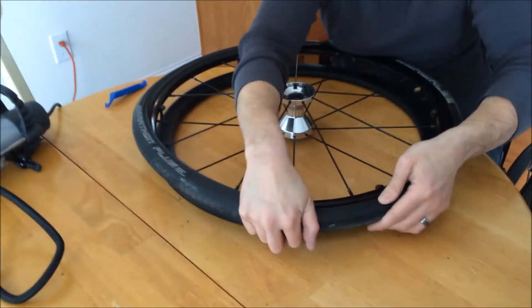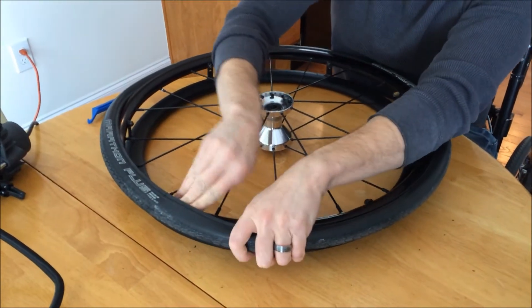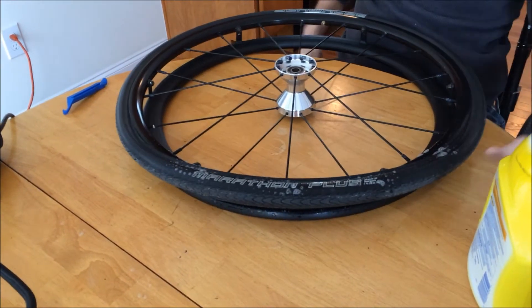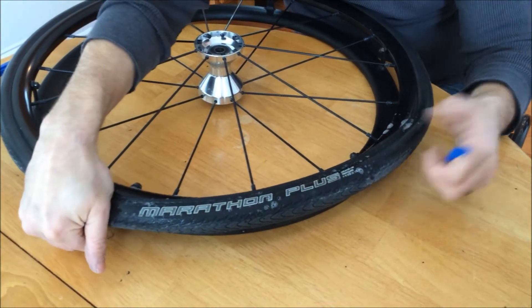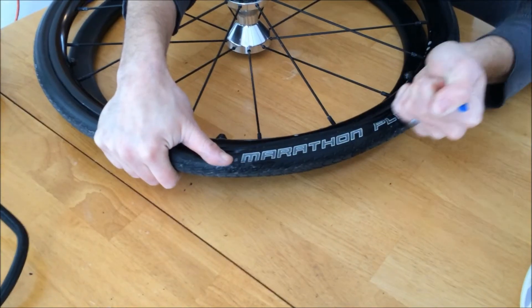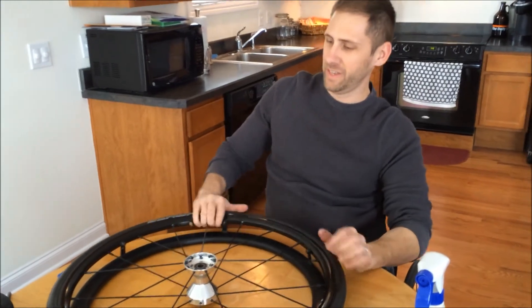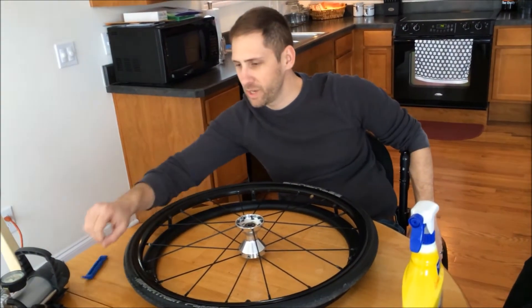Just like taking it off, this last little part is going to be kind of a pain to get on. Just kind of spray it down — this helps slide that back underneath the wheel where you need it to be. What I like to do is kind of hold it at one end, wedge this up under, and just kind of slide it the rest of the way around. Alright, so that's about as hard as that part gets — kind of a pain, but it is doable. This is a lot easier than rolling around on a flat tire for two days before you can get it to the shop.